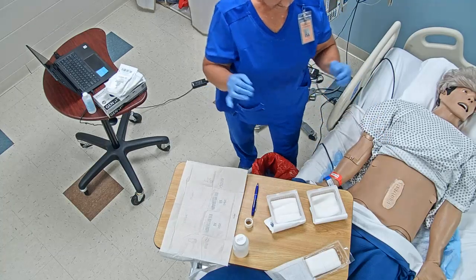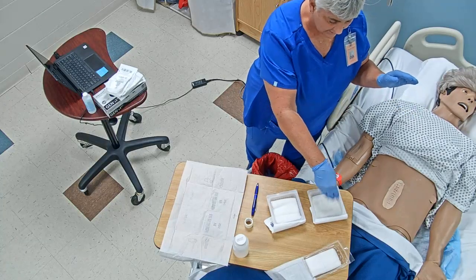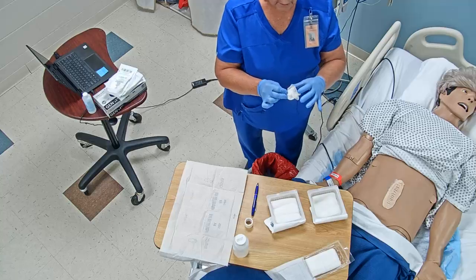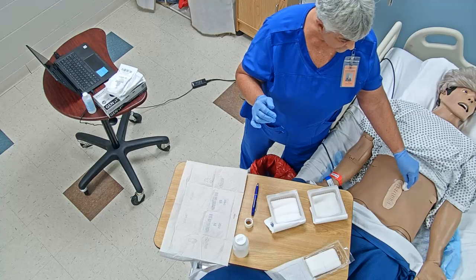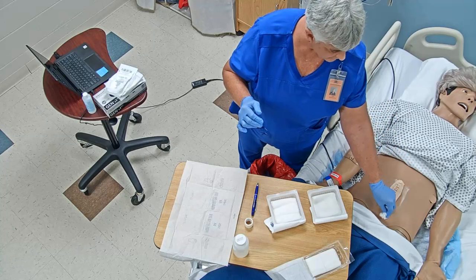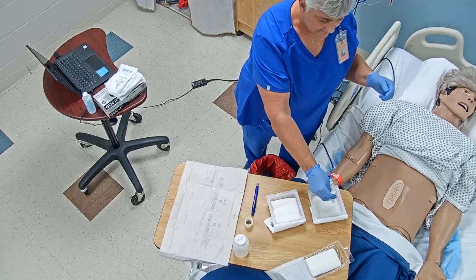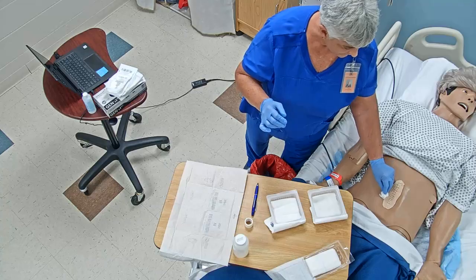Okay? Now the whole time I've got to make sure that this hand is not touching anything but the inside of this, and that this hand is not coming in contact with the gown or anything else like that. So transfer without touching. Now I'm going to do the next 2 inch, so I'm just going to be just a little bit, but you can see my arm is not going over the incision or where I've cleaned, just the glove part. Squeezing any excess out, transfer without touching, and now we're going to go out here.